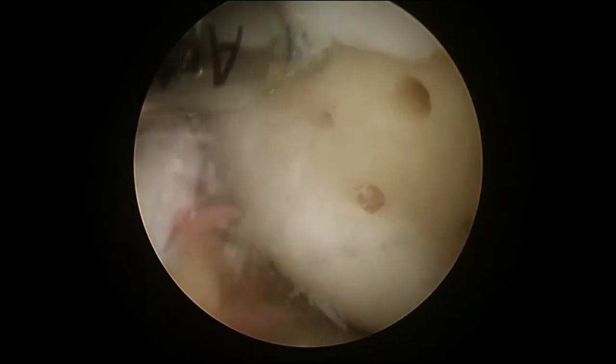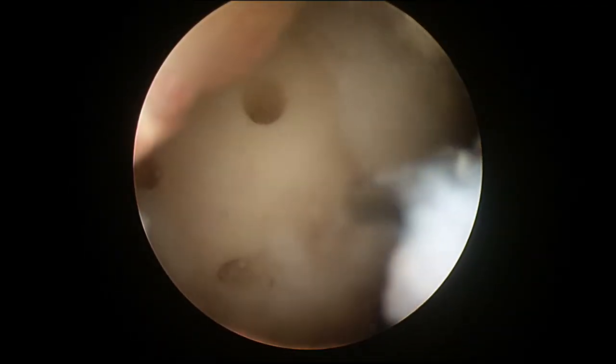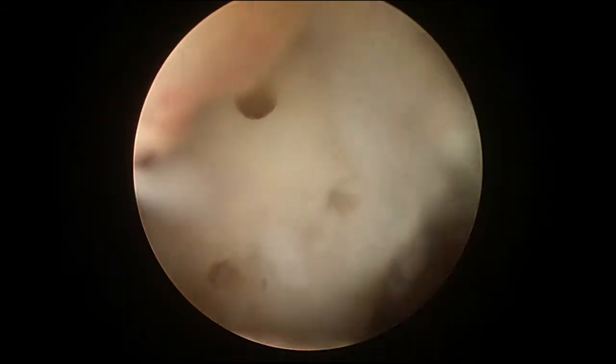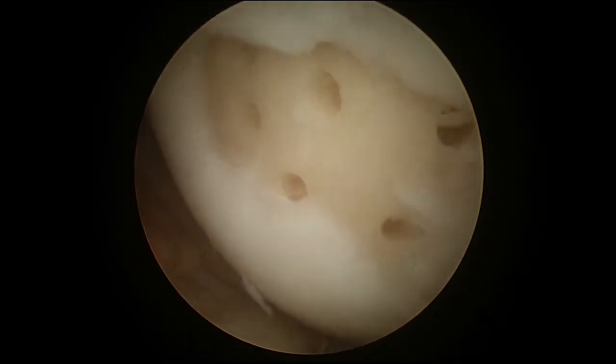It is ideal to space these holes out to 4-6mm. If they are too close together these sites can fracture together. My technique is to put several holes along the periphery and then a few holes centrally.